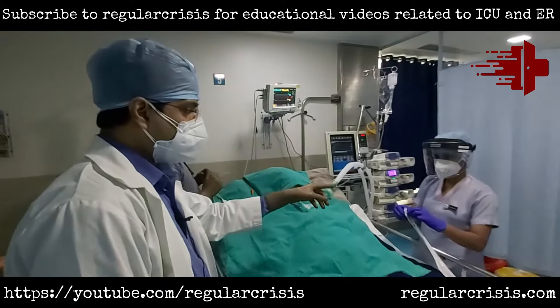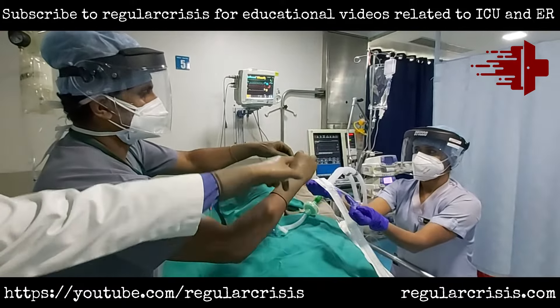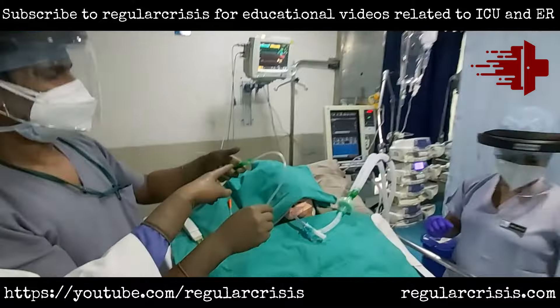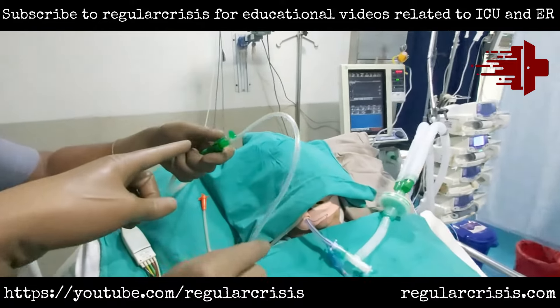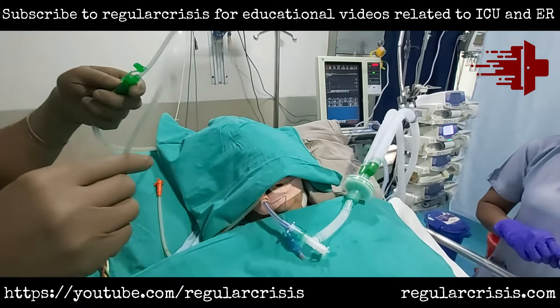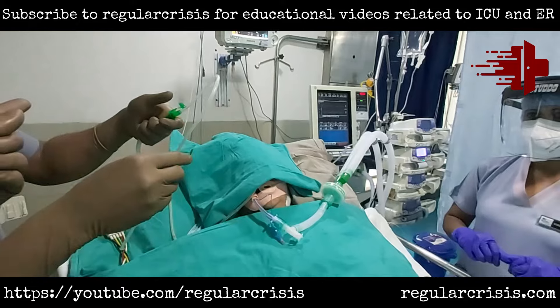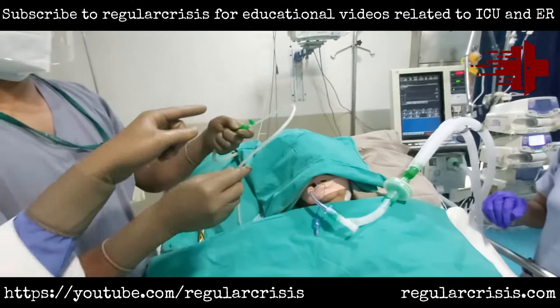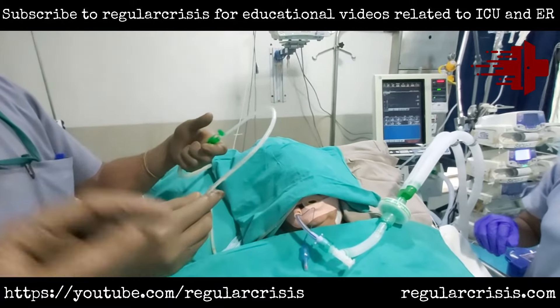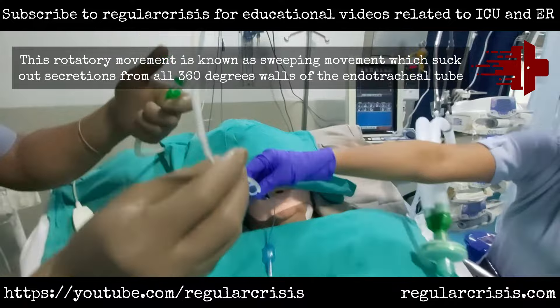First, the assistant opens the catheter packaging and hands it to the person performing suction with a sterile hand. Connect it to the suction tubing. This is a thumb-control suction catheter — using the thumb, you can control suction pressure to reduce trauma. While going inside the endotracheal tube, do not go the full length as previously explained, and keep the thumb control open so no pressure is applied on the way in.